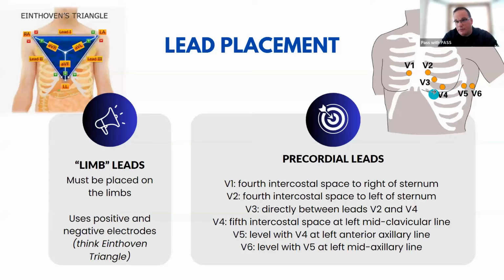If you really pay attention, both in the field and in the hospital setting, for some reason, we start to take V4, V5, and V6, and we start to do this wrapping pattern where we start ascending our leads as we wrap around our patients' backs. And again, I'm guilty of that as well. I'm certainly not going to act like I'm not. But proper placement should be V4, V5, and V6 in a straight line in that same horizontal plane as one another when we're applying them.